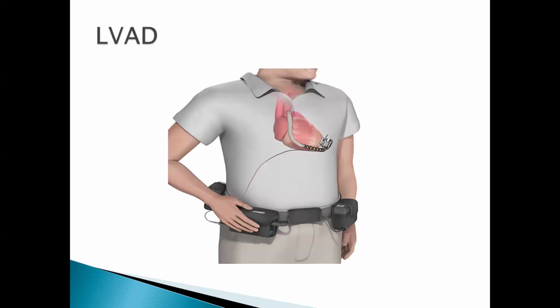Next slide, please. So this is more of a pictorial presentation of what a left ventricular assist device looks like. This is the battery that is powering the device, whereas this is the device itself that helps the heart to pump. Next slide, please.